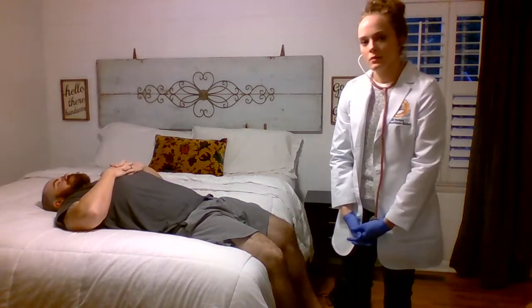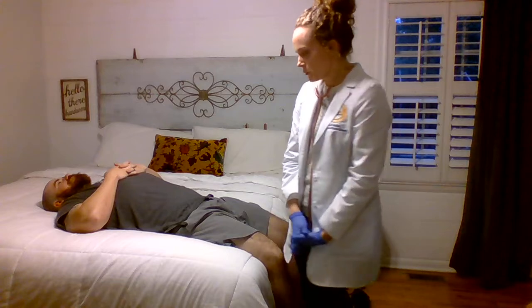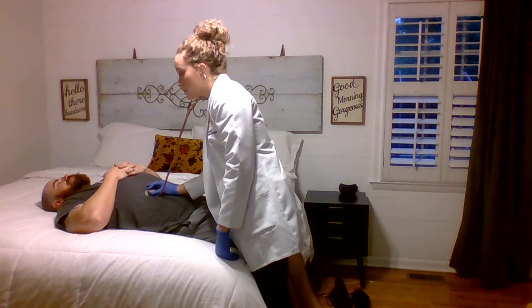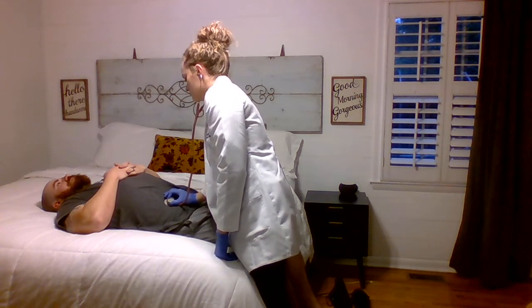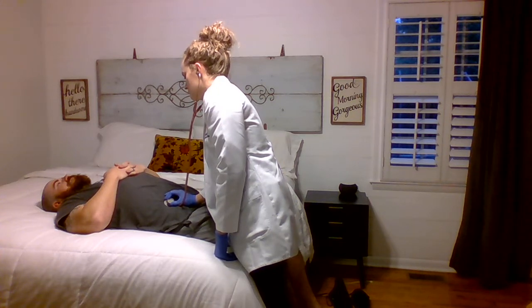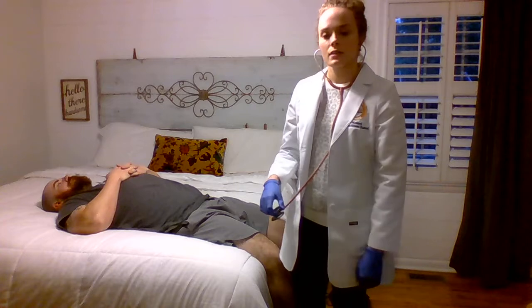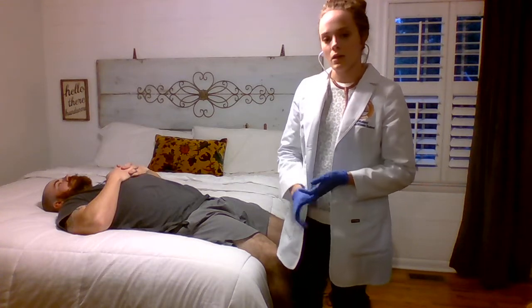Okay, looking at his abdomen, there's no striae, no bruising, no abnormal coloring. We're going to listen to his bowel sounds at this time in all 4 quadrants. Typically, you would listen for at least a minute in each quadrant. Okay, bowel sounds are active in all 4 quadrants. Now I'm going to auscultate the arteries in his abdomen. It'll be the aortic, the renal, the iliac, and the femoral, listening for any bruits or abnormalities.